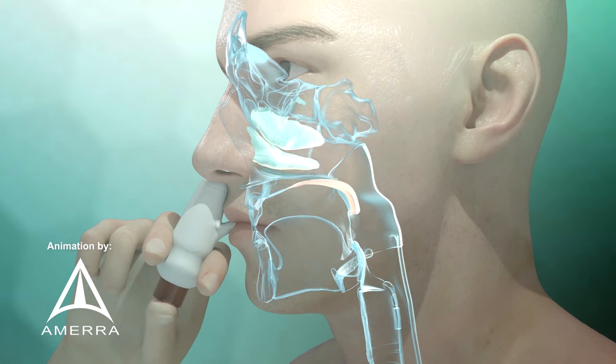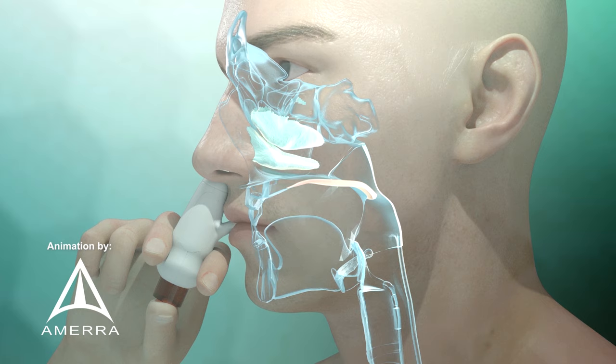Exhalation against the resistance of the device elevates the soft palate, creating an airtight seal that separates the nasal cavity from the oropharynx, just like blowing up a balloon.